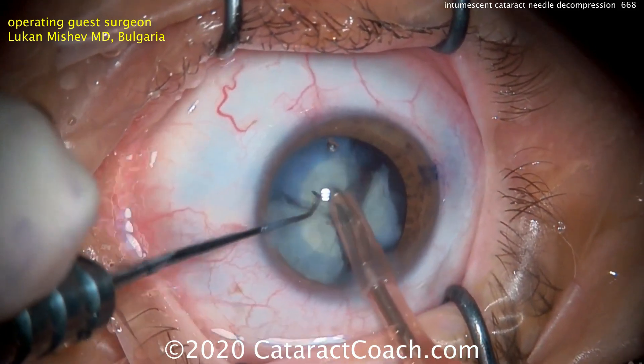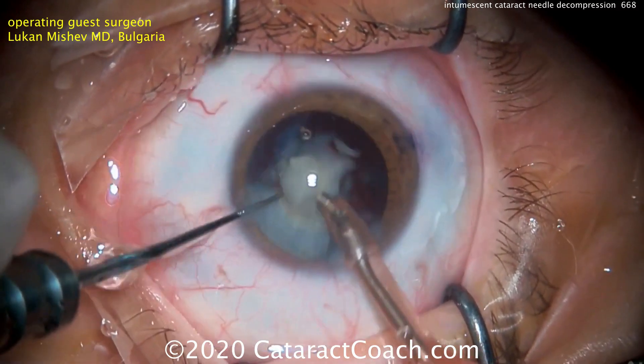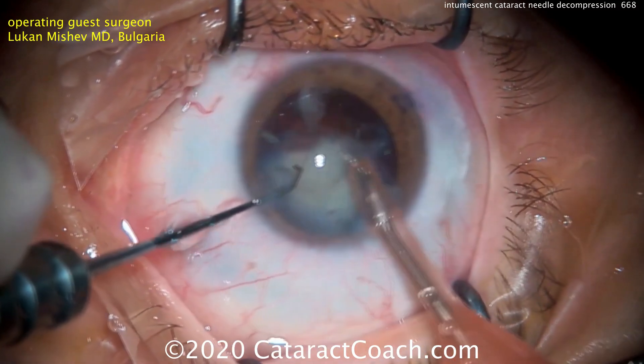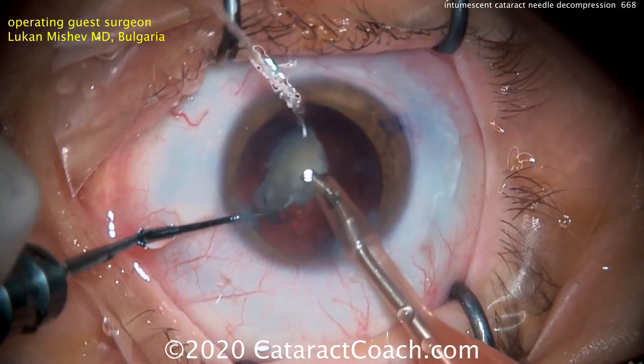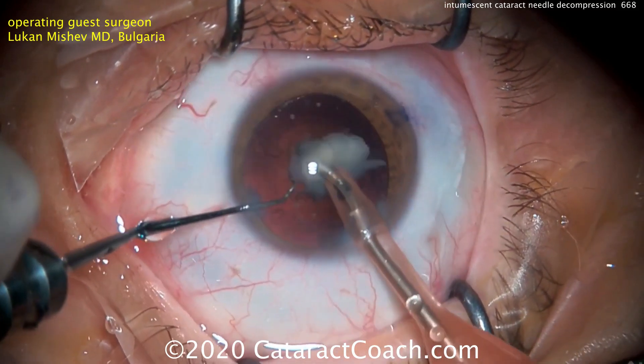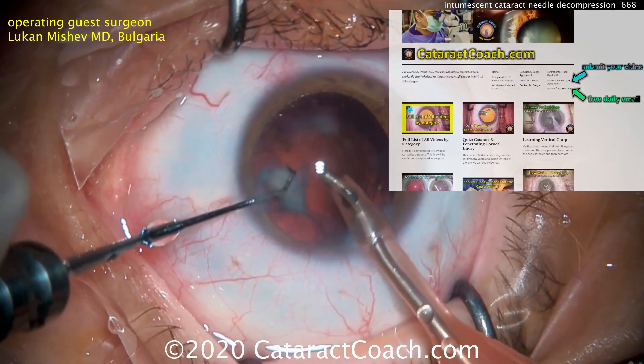Other techniques we've shown in the past include using the phaco probe to puncture the anterior lens capsule, using other devices, maybe even a femtosecond laser — but that's certainly very expensive — or even just using a small cystotome to do a double rhexis technique: a baby rhexis and then completing the larger rhexis.